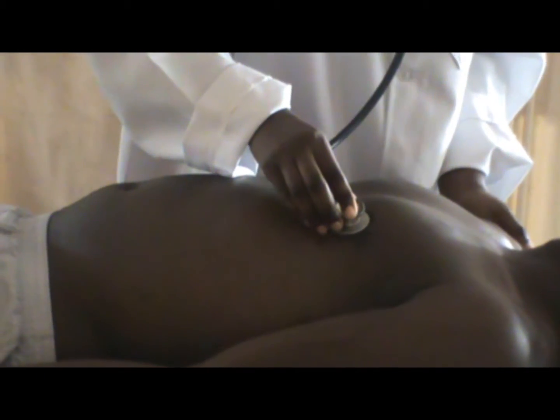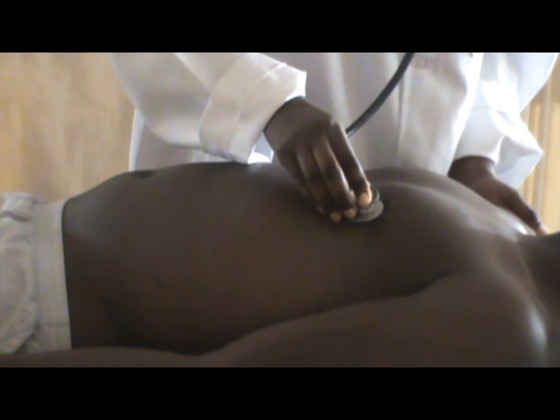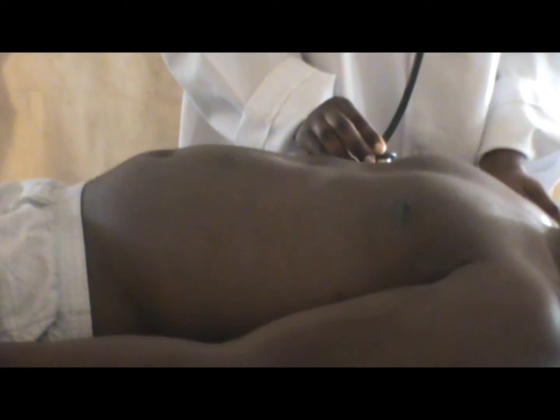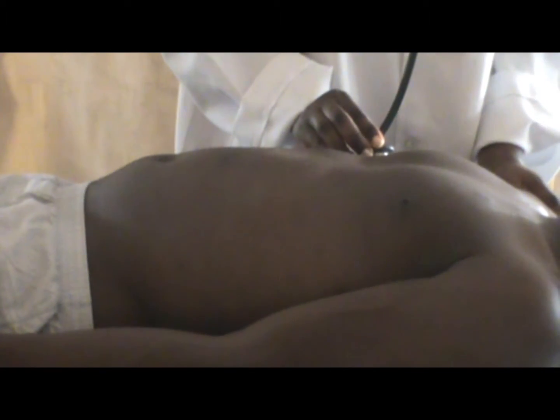To listen to the breath sounds, follow the same points of percussion in auscultation. To listen to heart sounds, try to follow the areas where the valves of the heart can be best heard. Also note the surface anatomy of the heart valves.